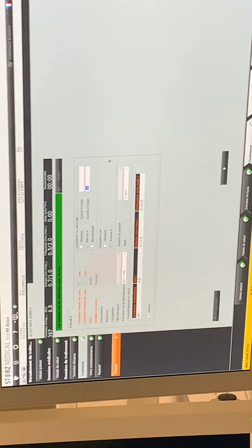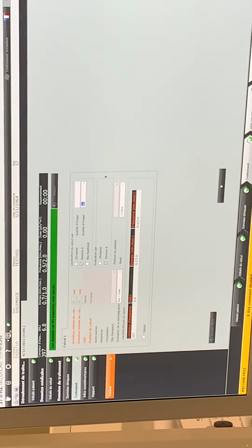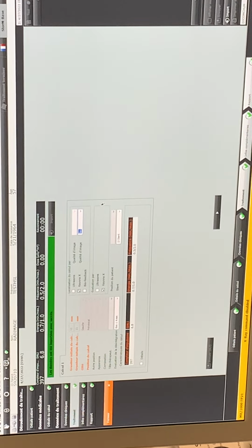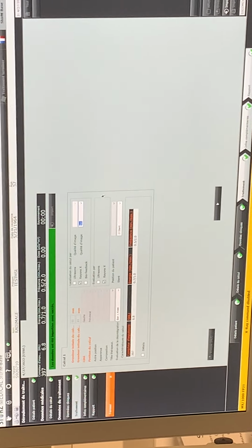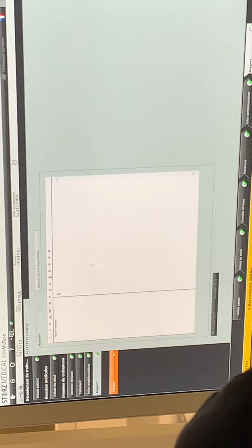Can I put all that with my ultrasound? Yes, of course. Not at the ultrasound system, but you need to do it here. Unfortunately, you cannot have the ultrasound pictures here. This is not possible. But you can send it to the PACS if it is configured, which is not configured at the moment. Okay. So people will have to trust me. Yes, I have to trust you.